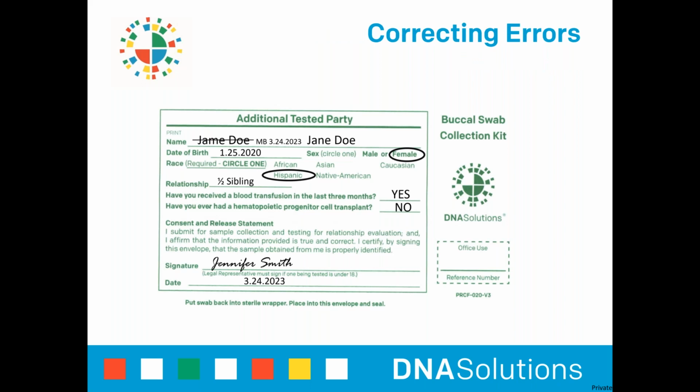Correcting errors made during a collection, whether on the chain of custody form or on a sample envelope, should be done by simply marking one line through the error, placing your initials and date, followed by the correction. Please do not use whiteout or obliterate the mistake by marking vigorously on the error.